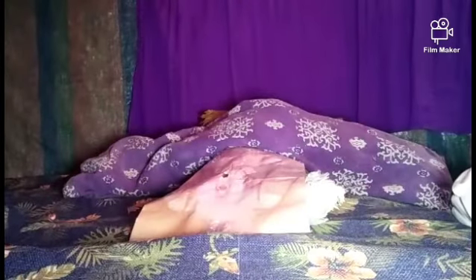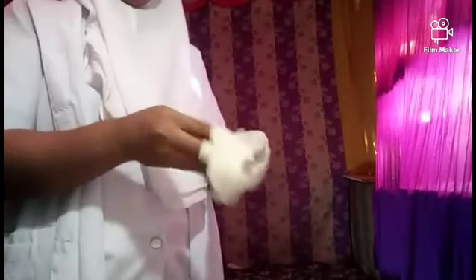Remove the absorbent towel and discard. Remove gloves and throw them away into the waste receptacle.